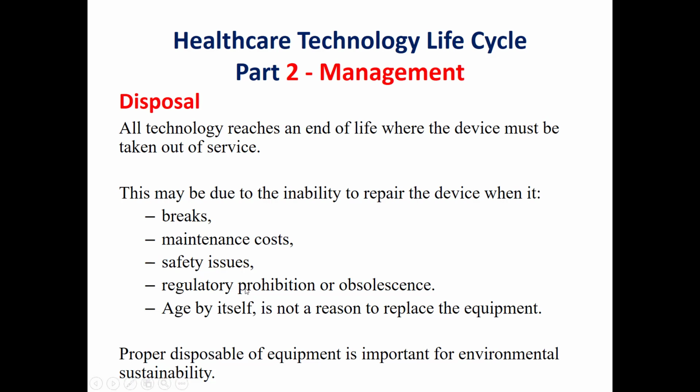Another reason is, as we said, the regulatory prohibition. Prohibition will be, for example, in Lebanon, as I said before, the formaldehyde gas, which is a cold sterilization, has been prohibited in Lebanon. So this is another reason to dispose of this device and take it out of service.